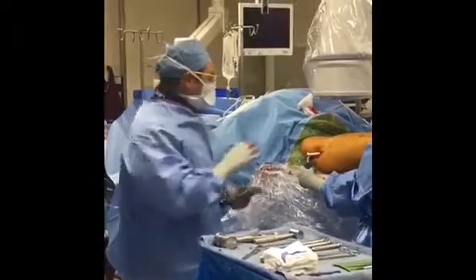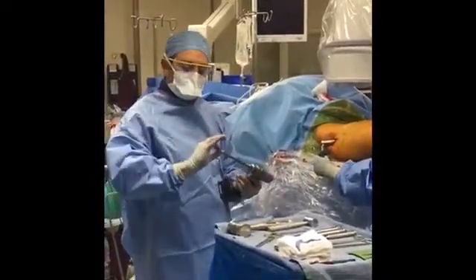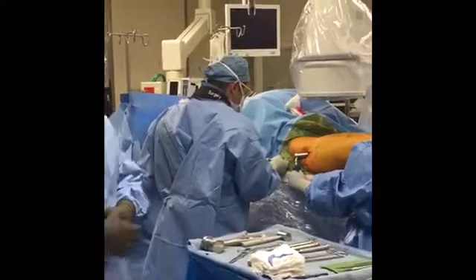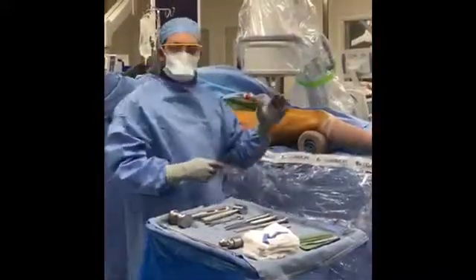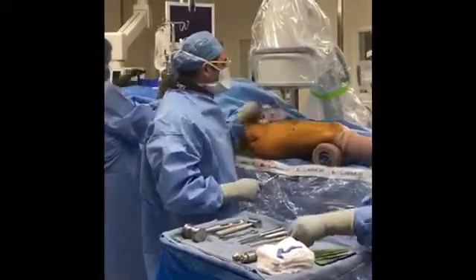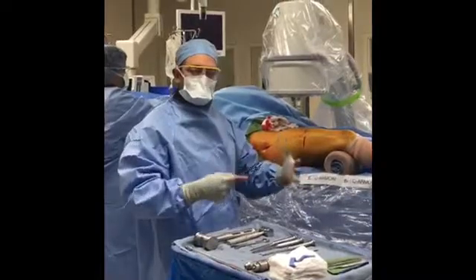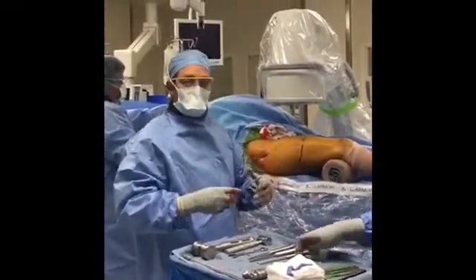The next step is to make sure that once we have the guide wire in place, we're gonna use this to ream basically an opening into the bone where the nail is going to be going through. Now we're measuring where exactly we're gonna cut the bone. We have confirmed on X-ray where it's gonna be, so we're gonna make a few little drill holes to allow ventilation during the reaming process so we get good seeding of the bone for the lengthening.